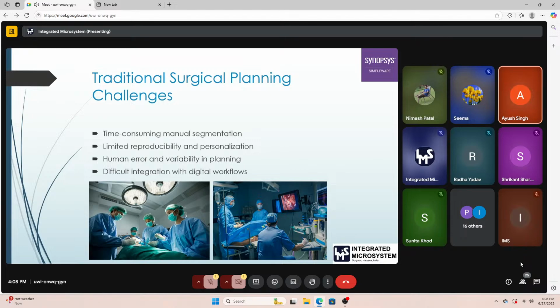So to cover that, we have a new software solution like Simpleware to overcome the requirement. We can do the 3D reconstruction of the model if required in some of the complex cases. If we are not yet satisfied with the generated output, we can also do the 3D printing of the same. This helps in reducing the mortality rate. Also, it increases the surgery success rate ultimately, which is our ultimate aim, to save a patient's life. While integrating any digital workflow, it definitely helps our specific requirement and reduces the computation time too.